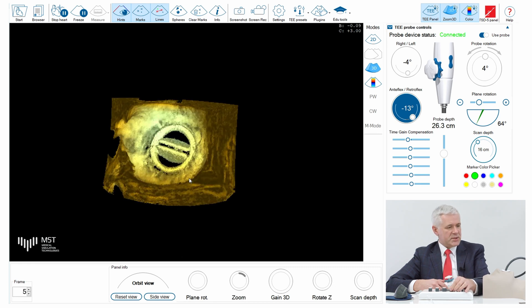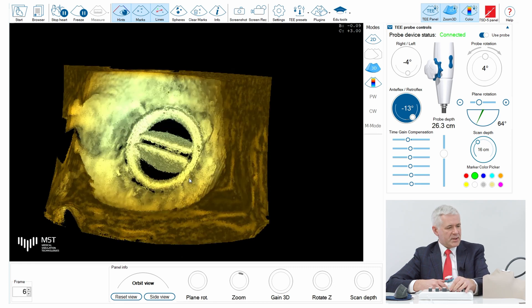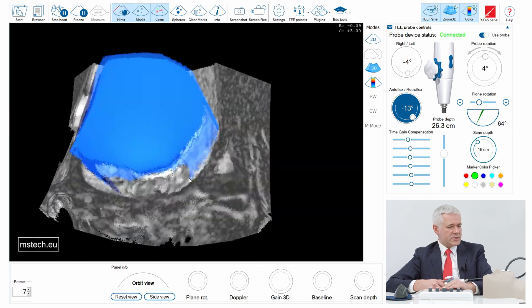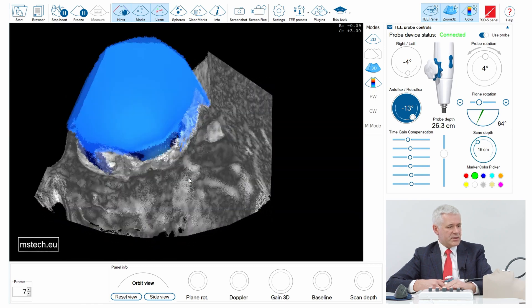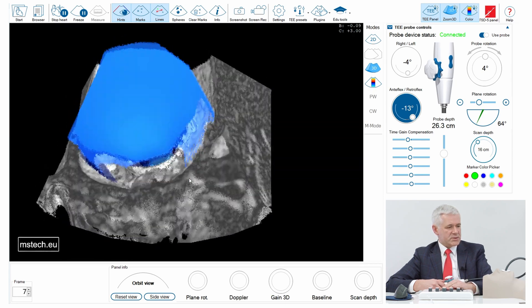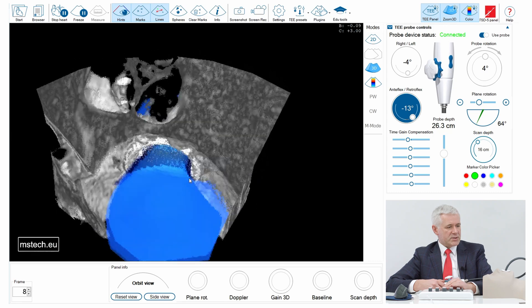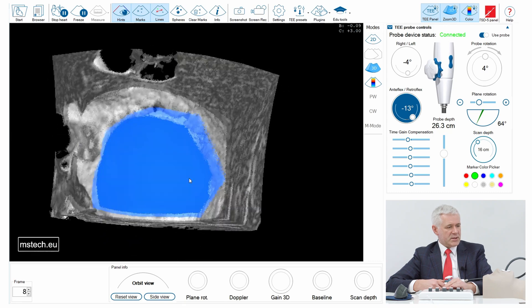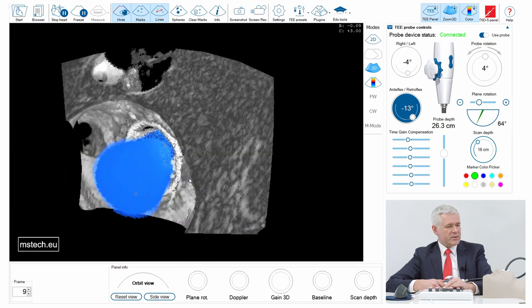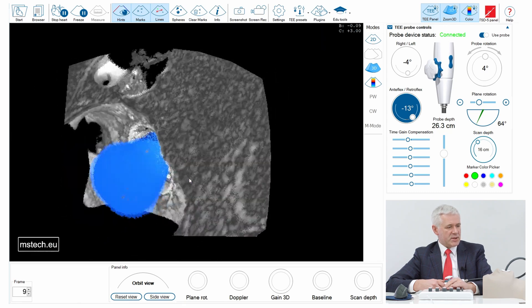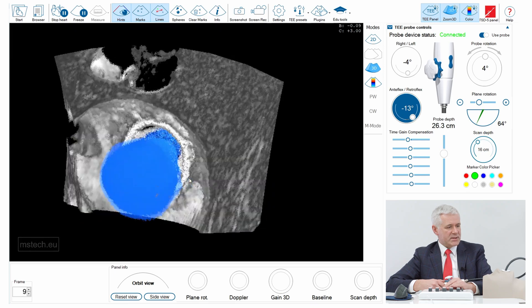I can zoom in and activate color again, and here you see the leak, which is not really big — just a tiny leak near the left atrial appendage, which can be seen on the left-hand side.